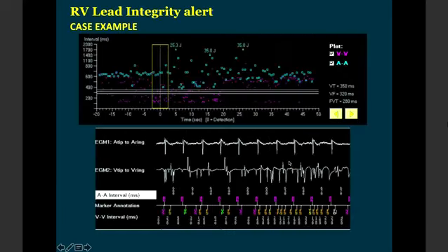Alright? And if you look at this interval plot here, there are multiple episodes in the VF range needing multiple shocks. You see the EGM, I repeat again, the near field is full of disturbance, causing the so-called detection of fibrillation, but the atrial EGM is very clean, but the near field EGM is completely full of noise here, which comes in the ventricular fibrillation range. So fibrillation is detected and fibrillation gets treated. And that is why this patient had multiple shocks.